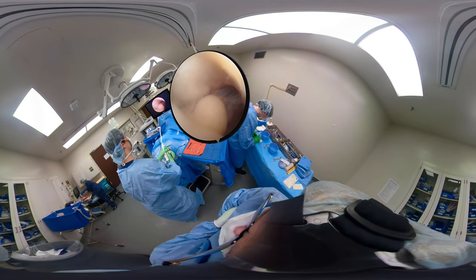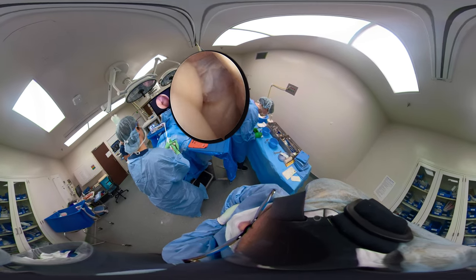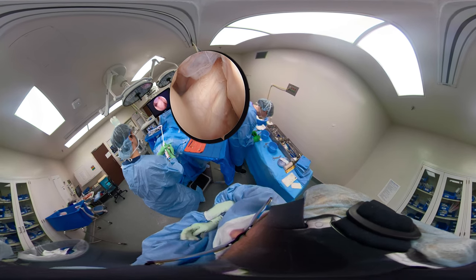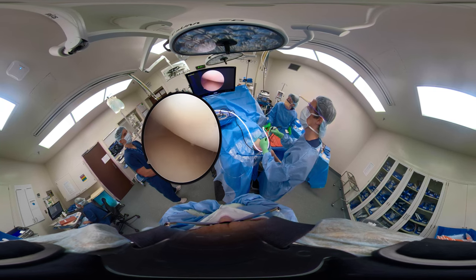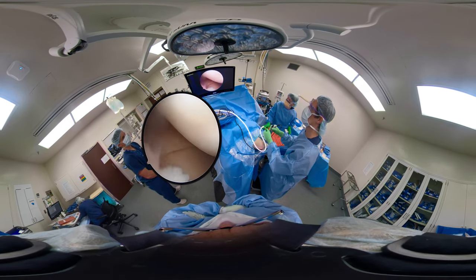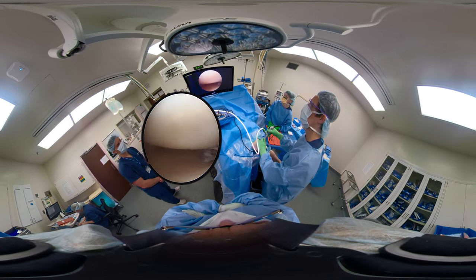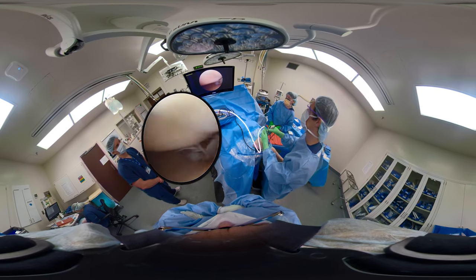Looking at the ligament of mucosum. Fat pad is your enemy — you have to drive past or posterior to the fat pad to be able to see. Anterior cruciate ligament. We haven't established the medial portal yet. His right leg has a little step up, which ergonomically makes your calf not get too tired. Holding the scope with his right hand, and now we're going to crank into valgus to open up that medial compartment and establish the medial working portal.